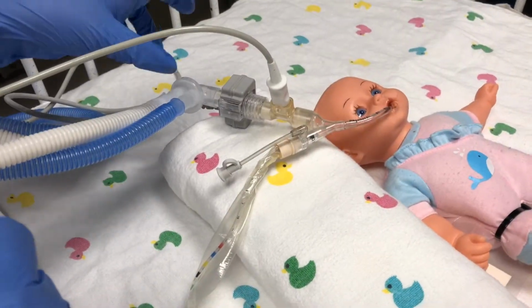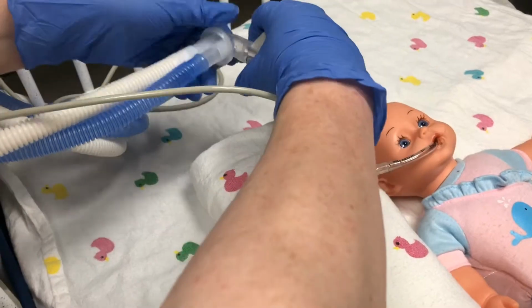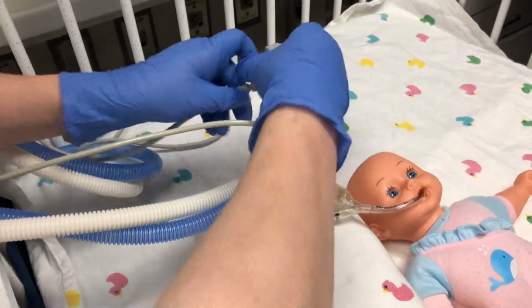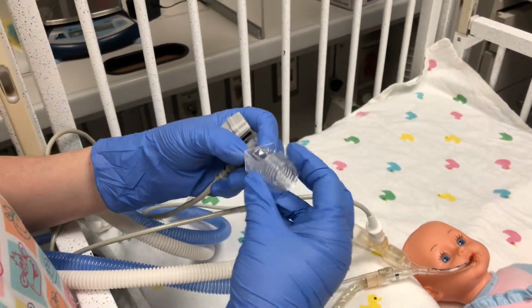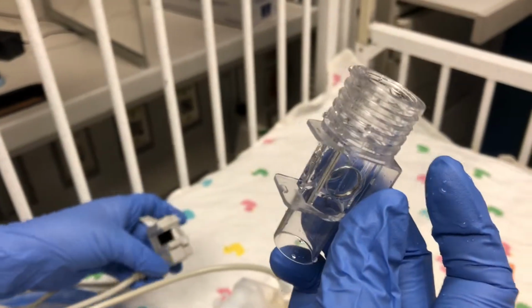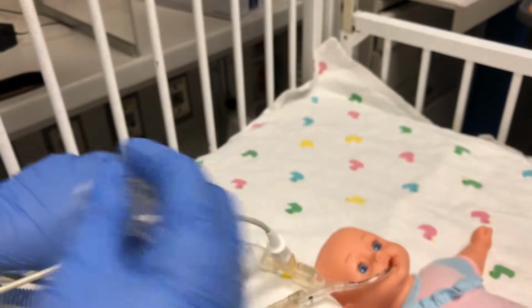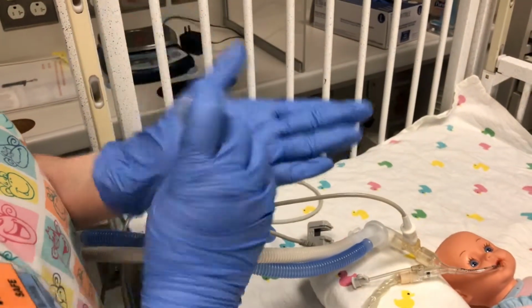So the first thing you want to do to troubleshoot it is you're going to go ahead and take it out of the circuit. Okay. And what you want to do is you want to take it off and look to see if you have any moisture in here. So if you have any condensation or moisture in here, it can affect its ability to read accurately. So the first thing that you'll do is try to tap out all the moisture that you see.